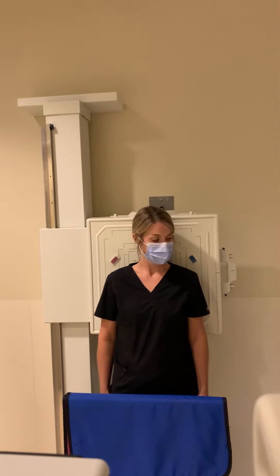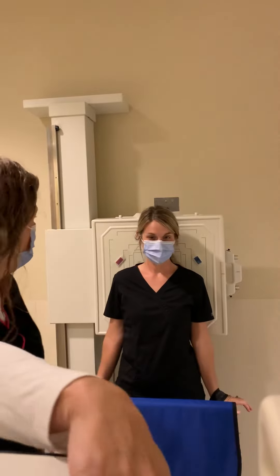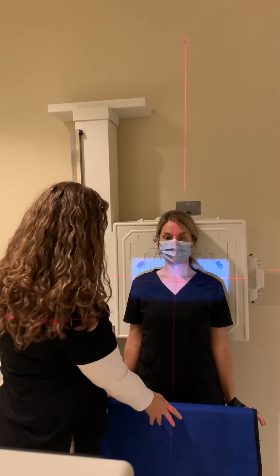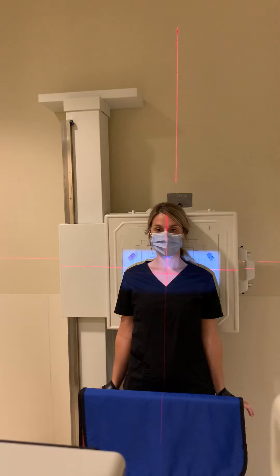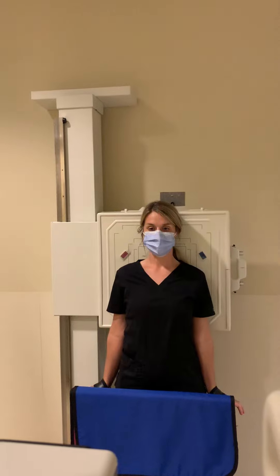Now we'll demonstrate with weights. You walk up, hand your patient the weights, have them place them on their arms and hold — let it pull their arm down, so they're not pulling their shoulders up. Everything else stays the same: centered at the level of the AC joints, left and right markers, 72 inches, shielded, and we're ready to take the image.